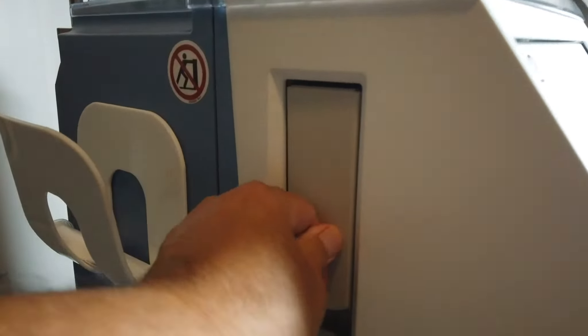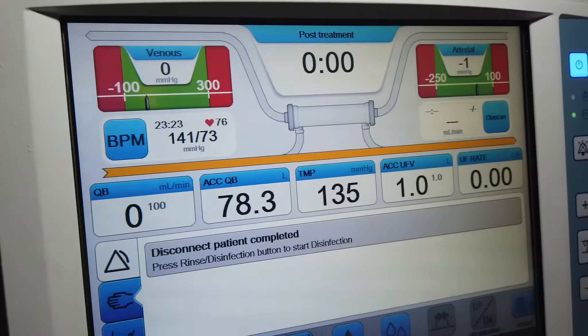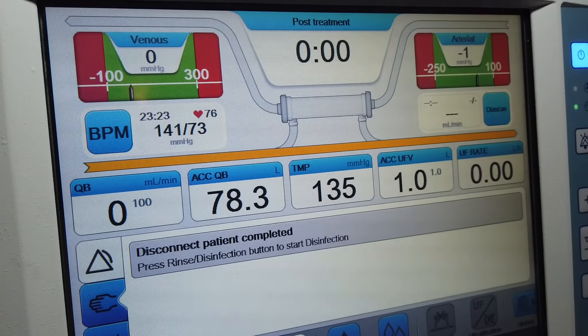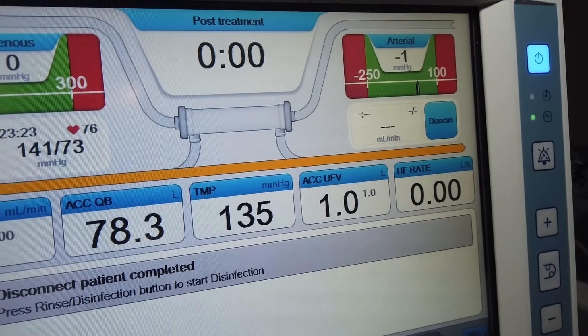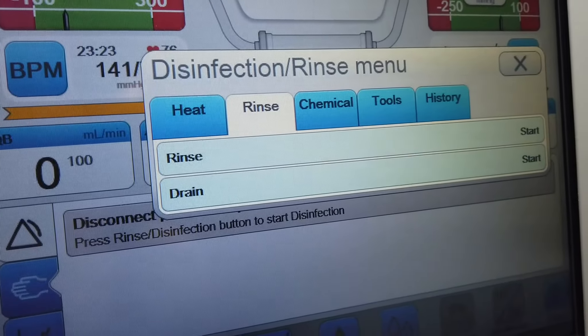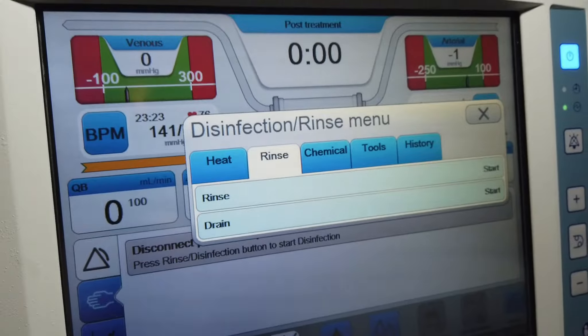The hatch is now closed, and now we have the menu that allows you to press the rinse and disinfect button to start disinfection. So we press this button here.